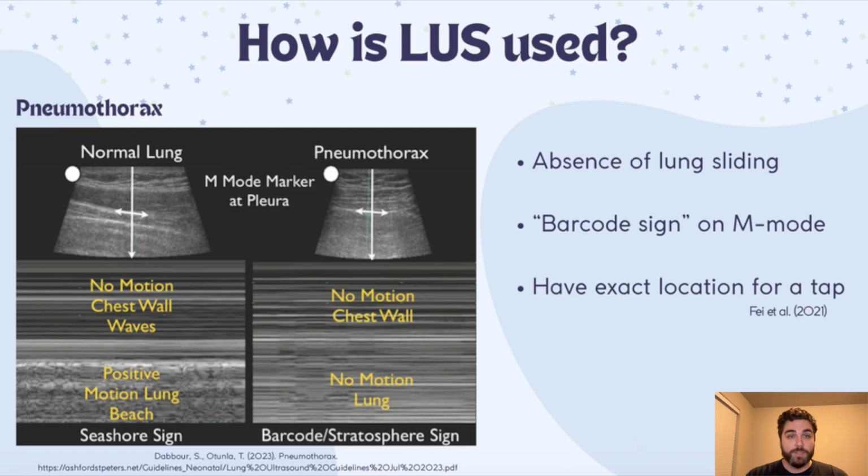All of the images that we have seen so far of the lung ultrasound have been this very wide range of view, not very deep into the patient's scanning the patient, but just kind of more wide range. Well, the lung ultrasound has an option to switch it to M mode, which is basically focusing the sound into a very narrow beam that kind of shoots through to monitor motion. That's what that M mode stands for.